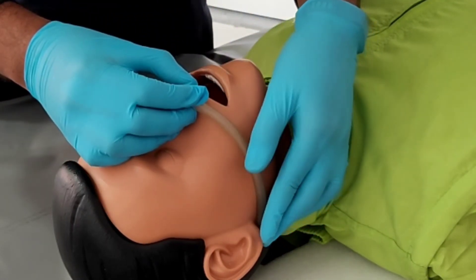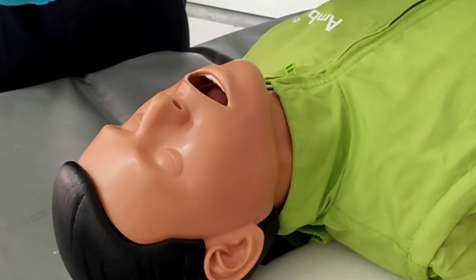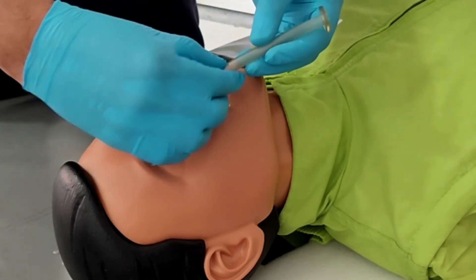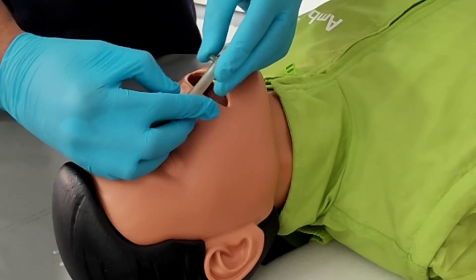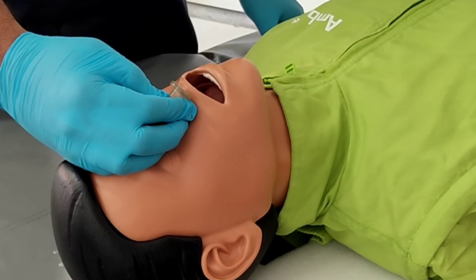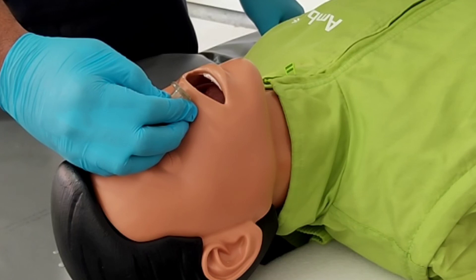Now let's see insertion of the nasal airway. Determine the size by measuring the distance from the tip of the nostrils to the patient's earlobe. Coat the tip with a water-soluble lubricant. Insert the lubricated airway into the larger nostril with the curvature following the floor of the nasal passage, bevel facing the septum. Gently advance the airway. If using the left nostril, insert until it meets resistance, then rotate the airway 180 degrees into position — this rotation is not required for the right nostril. Continue until the flange rests against the nostril. If you feel any resistance or obstruction, remove the airway and insert into the other nostril.